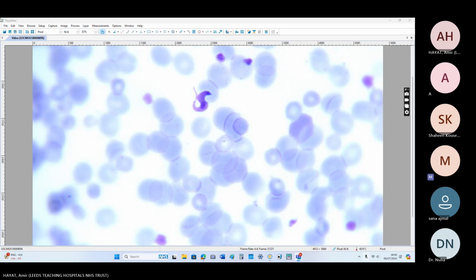This parasite has a very prominent kinetoplast. That's why I thought so, and the size, because recently I received from CAP a Brucey that was bigger with a dot type of kinetoplast. I reported this one as Cruzi, and their answer was also Cruzi.